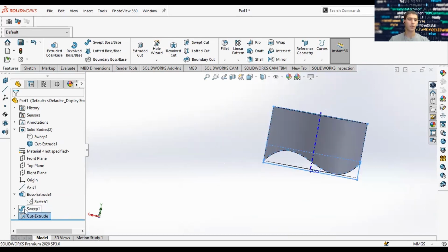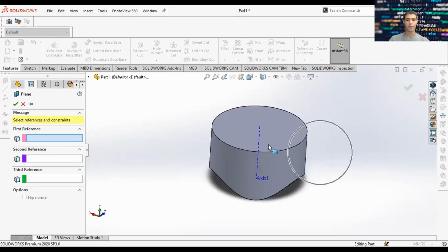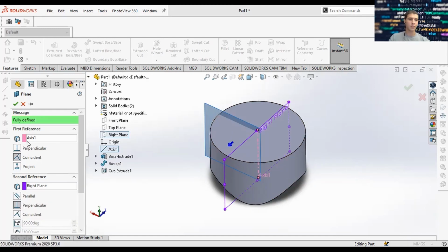What's next? So now you'll notice we have our cylinder and we have the shape of the scallop curve-driven function. Let's go ahead and include a reference geometry. And this reference geometry will be helpful in creating the lofts or the ridge for this cuff, because the cuffs are sewn together, and so it has a polyester covering or a polyester coating around this titanium band. Let's go ahead and finish making our reference plane.